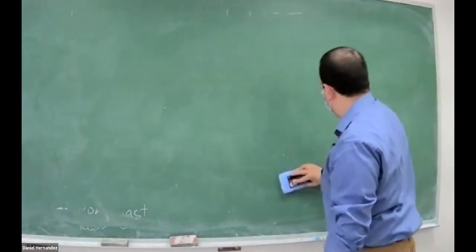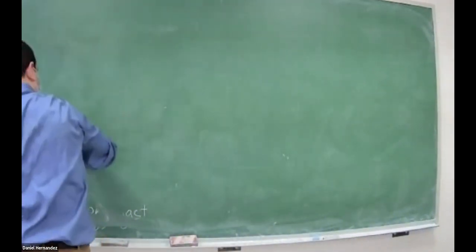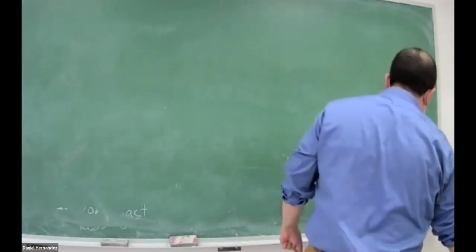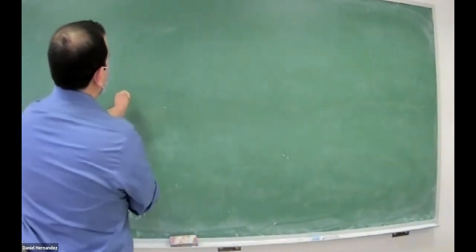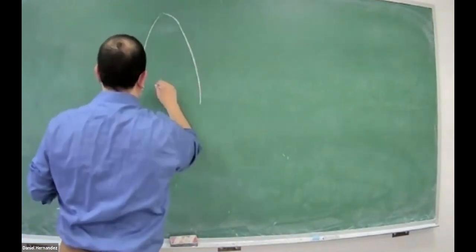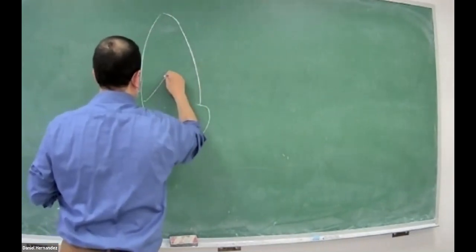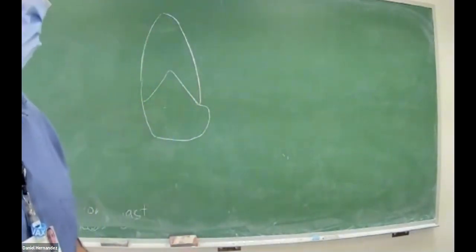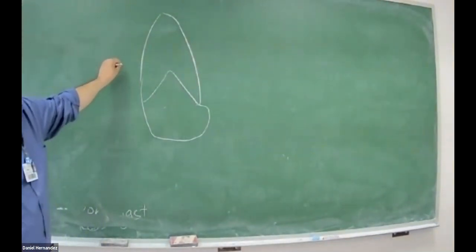Know some of your, be familiar with some of your wall segments for your coronary artery vessels. So like some of the major ones. So if we draw like our apical two-chamber view, do you know your wall segments? Like which side of the wall is that?